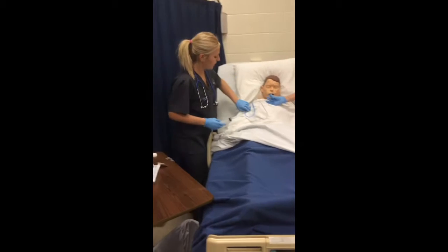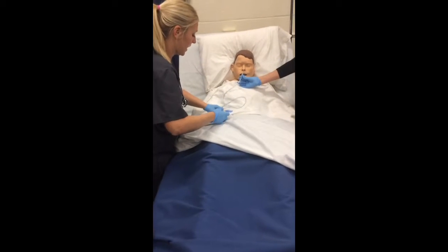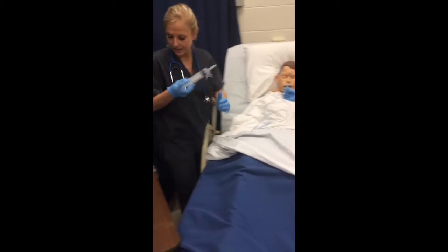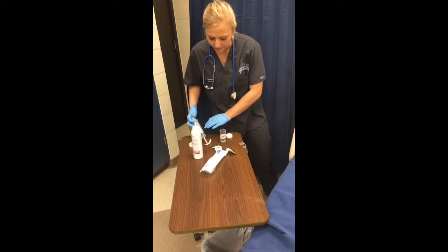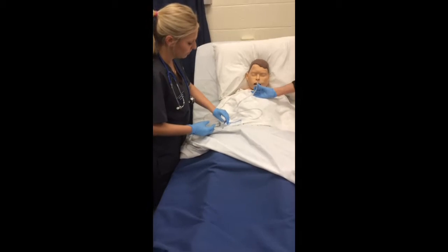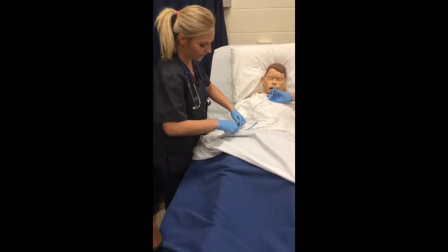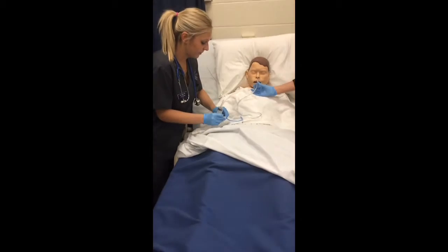Alright, and at this point we are going to check to make sure it is in place, first by bringing out stomach acid. Alright, we've got some, and we're going to disconnect it and test it on the pH tape. Alright, and it should be anywhere from 2 to 5 on the pH scale. We're going to re-enter this. Okay, at this point we're going to wipe it off.